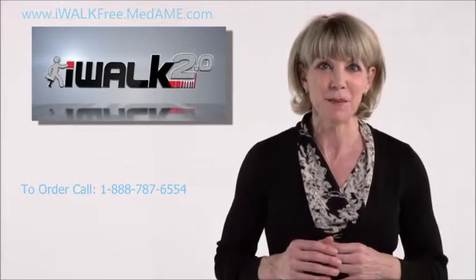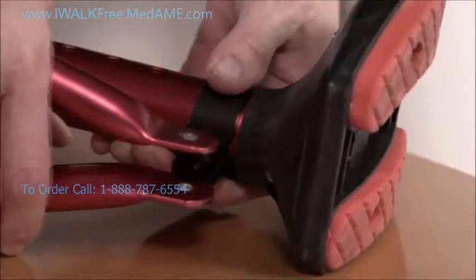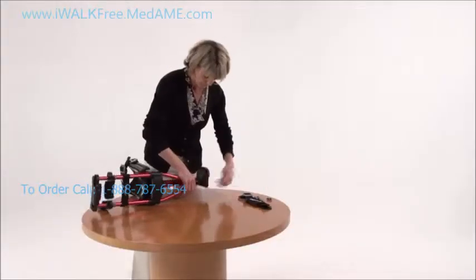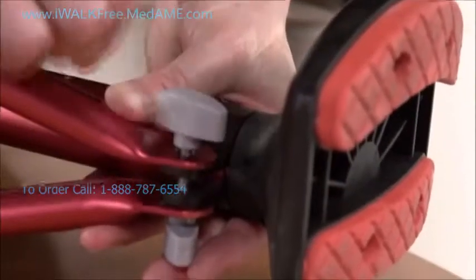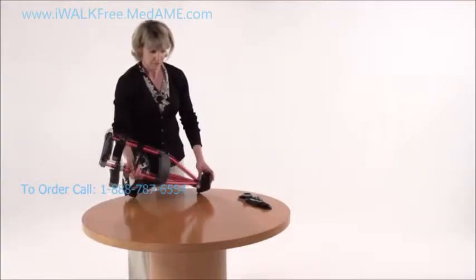The next step is to install the support tube into the clamp. Sandwich the clamp between the ends of the support tubes like this, then align the holes and, using just a little bit of pressure, slip the T-head bolt right through them. Then thread on the T-head nut, but leave it loose for now.